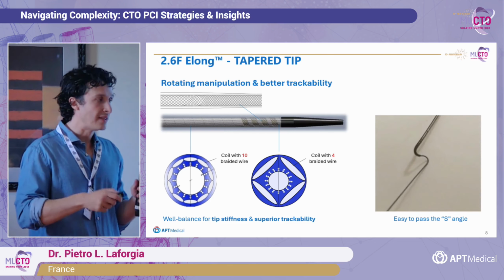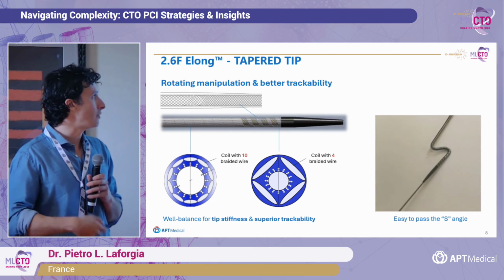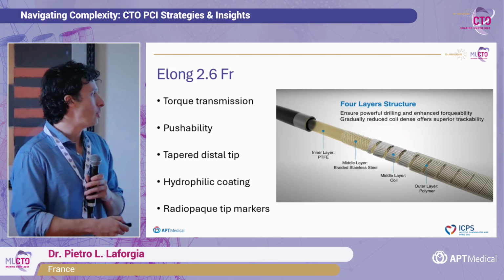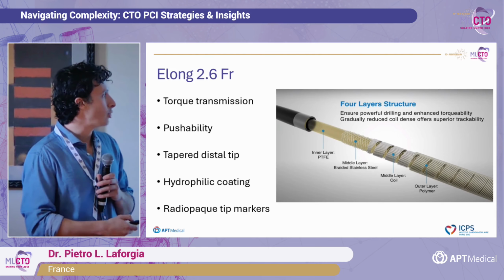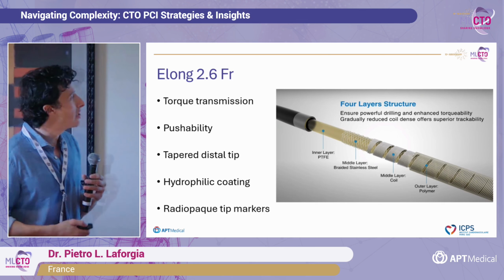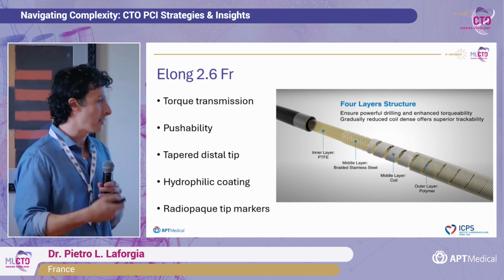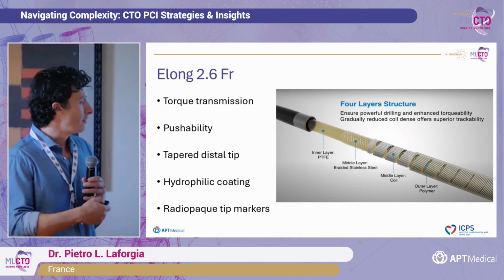We need to advance while rotating anticlockwise. It gives you very good pushability, very good trackability. You can see here in the video. I will not stick to all the engineering behind it, because it's not what I really need in doing my cases, but the fact that I use it most of the time is that it always gives me very good results, because it's very easy to torque.